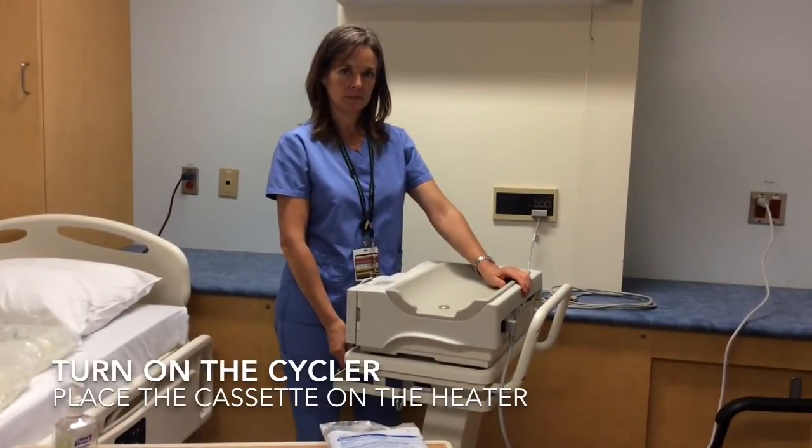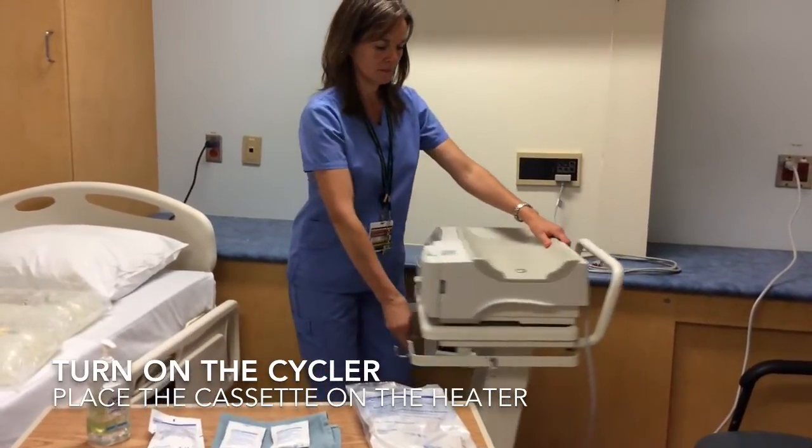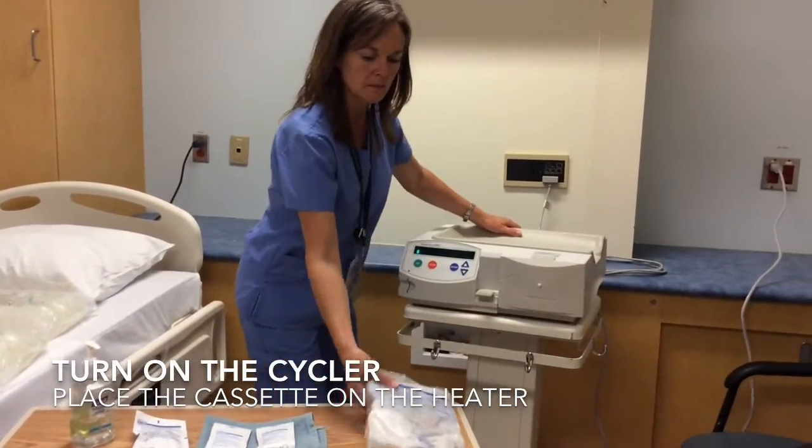When you start, turn on the Cycler. The switch is on the back. Take the cassette and put it on top of the Cycler so that it warms it up.